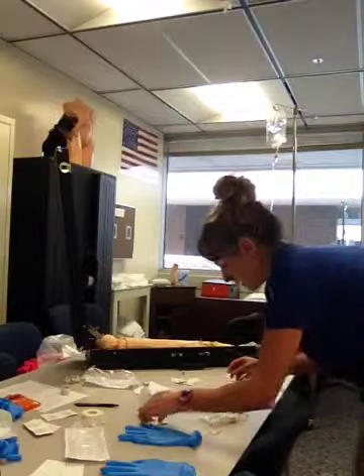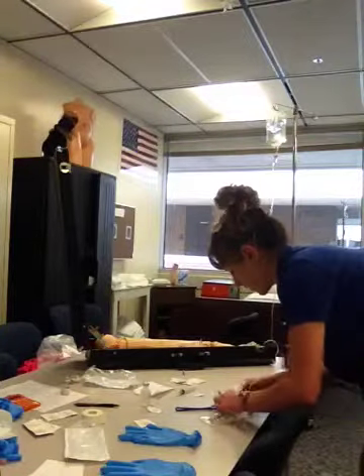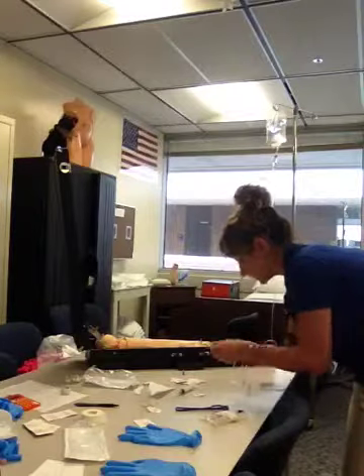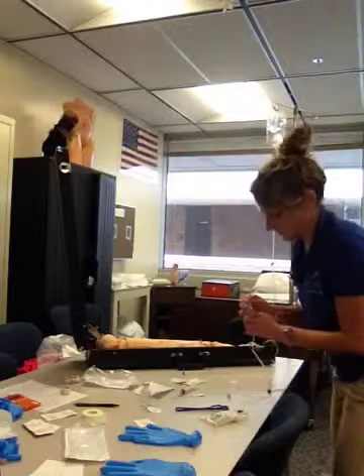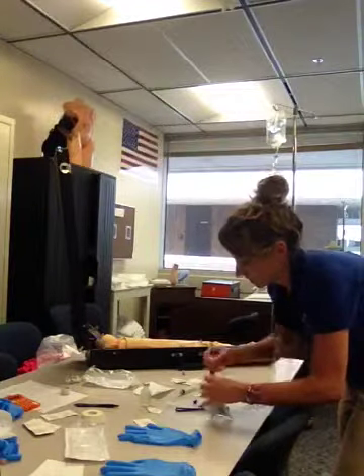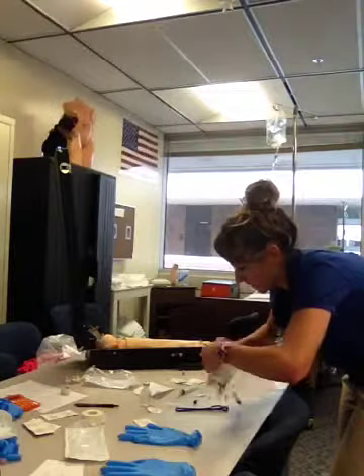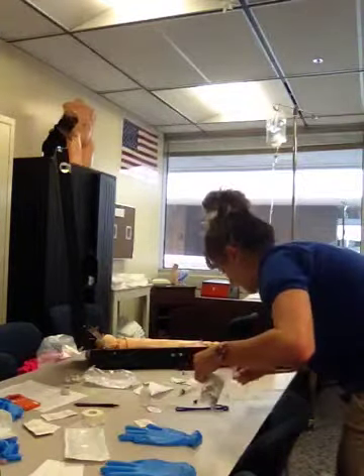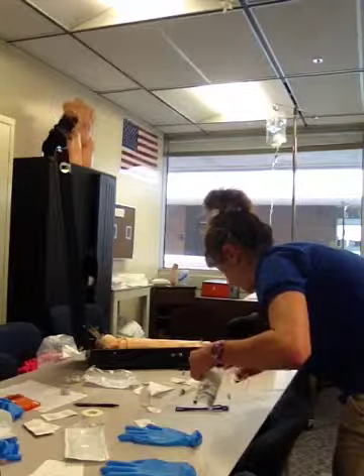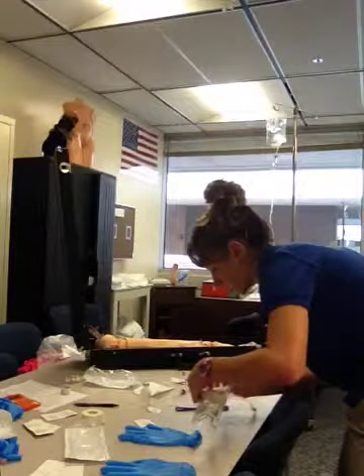And next, I'm going to prime the line to the end, and once primed, close it again, and now I'm going to add a label to our tubing with my initials, the date, and the time.